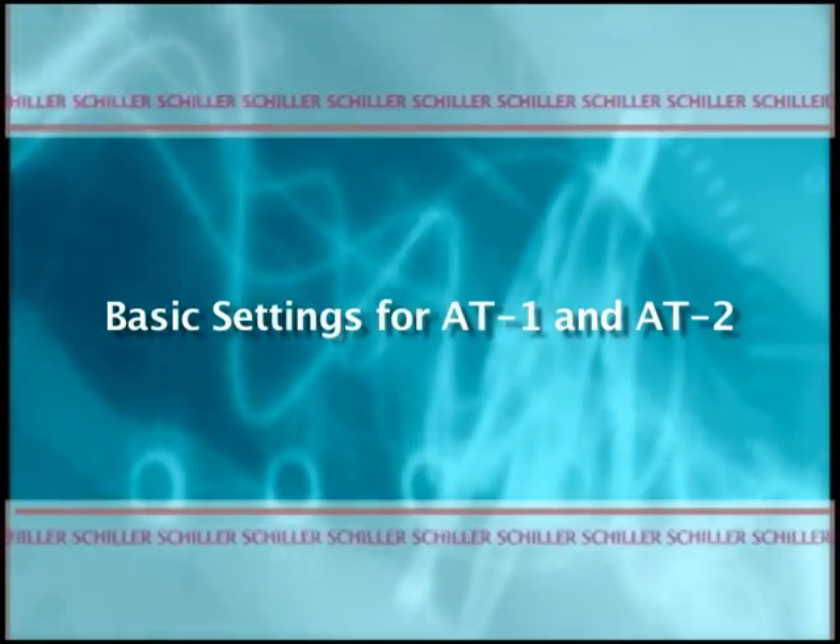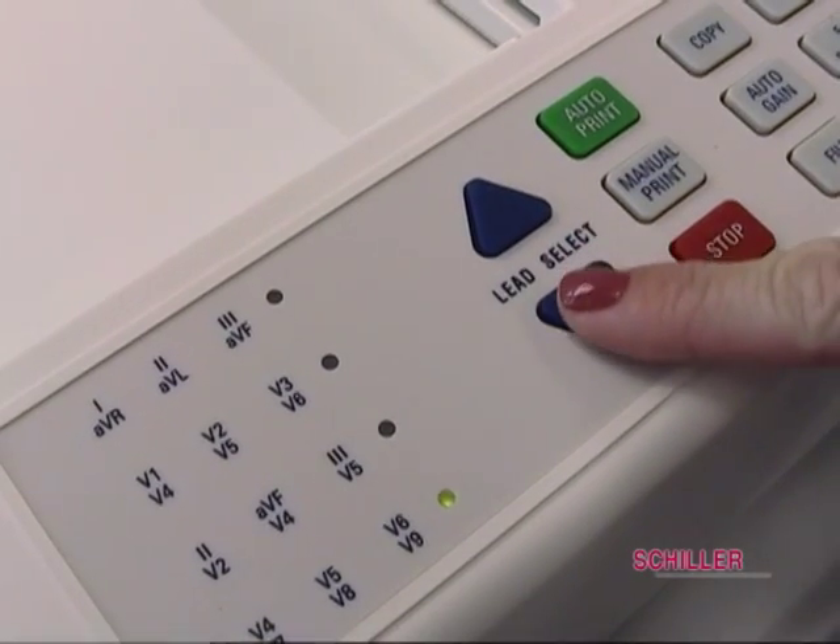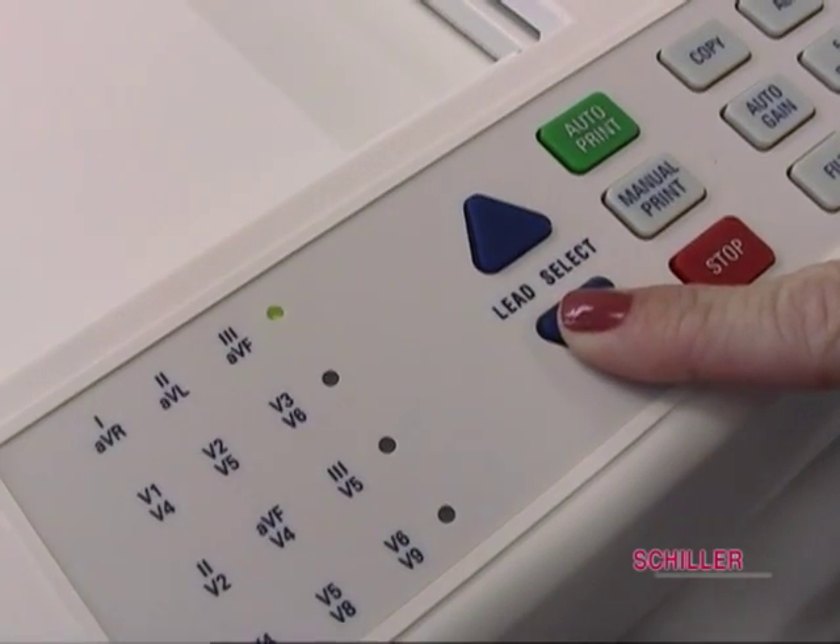Basic settings for AT1 and AT2. Button operation for the AT1 and AT2 are the same.